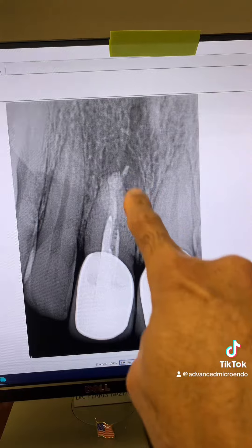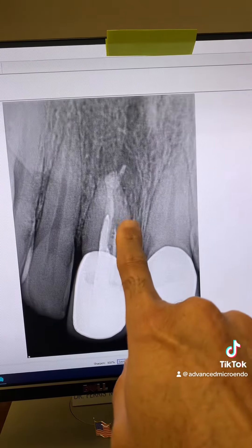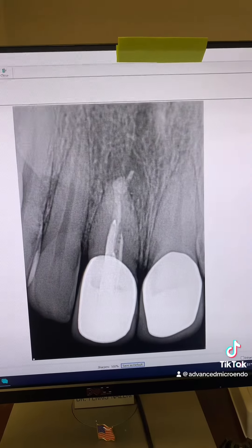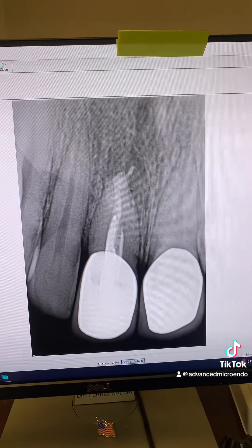The good thing about MTA is that in larger diameter canals it seals much better and gives you a much better apical seal compared to gutta-percha.